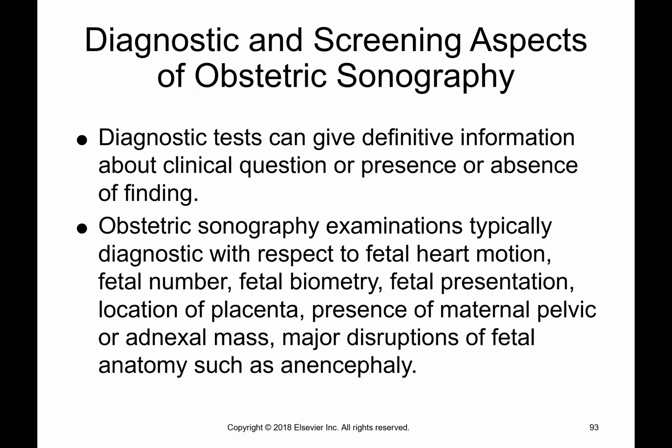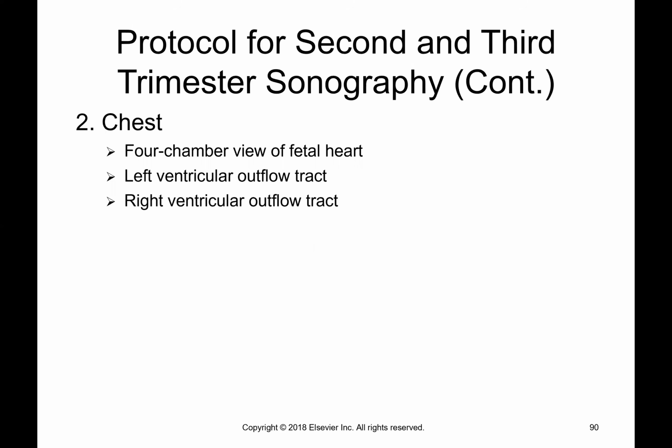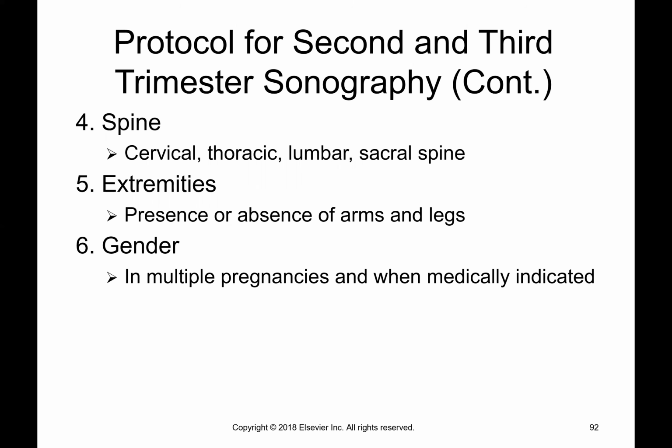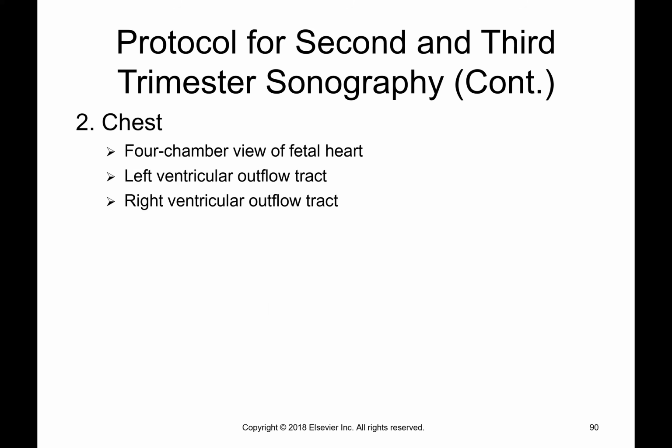Now, the funny thing is when patients come in, a lot of the time they have no idea what we do, that we don't just take pictures of the baby. We're also examining the baby to make sure that they're okay and they look good, and that there are no fetal anomalies. But it makes me laugh when I come in. I'm like, do you want to know the gender of the baby? And they're like, isn't that what we're here for? Well, yes. But also, we want to make sure there are arms and legs and the spine looks good and there are no heart defects and all this other stuff. And it's really not anybody's fault. They just don't know what all goes into our job.